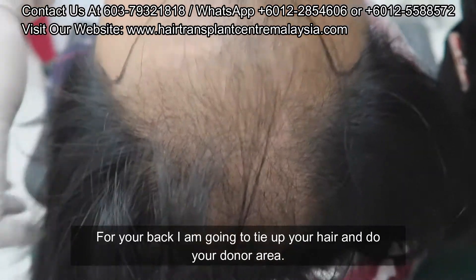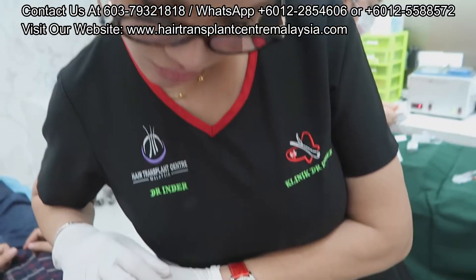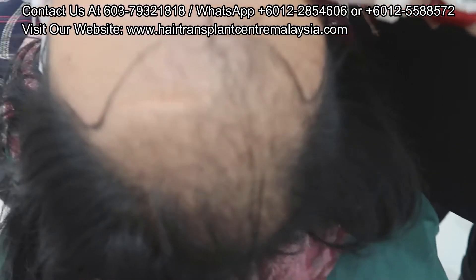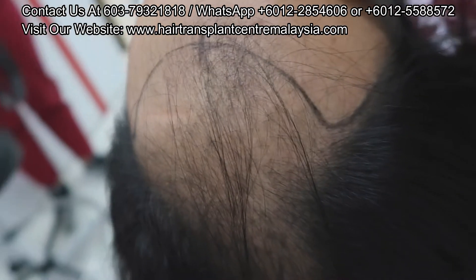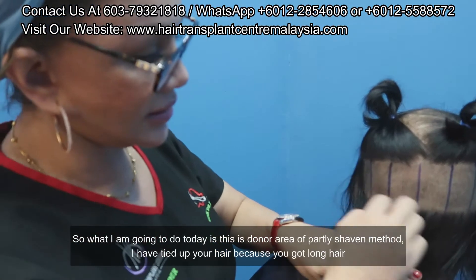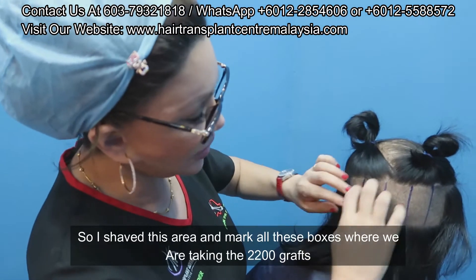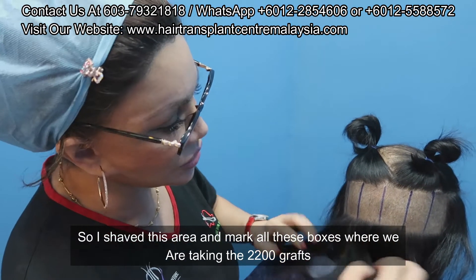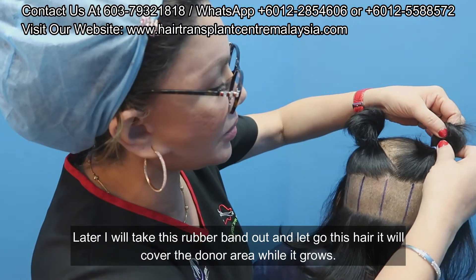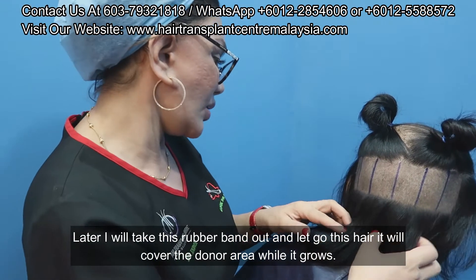For your back, I'm going to tie up your hair and do the donor area. What I'm going to do today is partially shave this donor area. I've tied up your hair because you've got long hair, so I'll shave this area and mark all these boxes where I'll be doing 2,200 grafts. Later when I take this rubber band out and let go of the hair, it will cover the donor area while it grows.